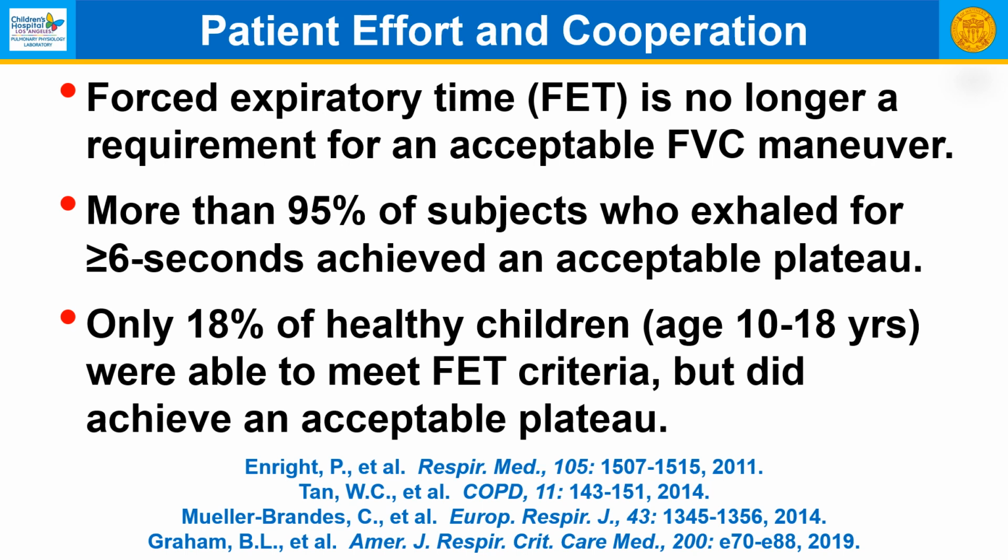More than 95% of subjects who exhaled for greater than 6 seconds achieved an acceptable plateau, but only 18% of healthy children aged 10 to 18 were able to meet the forced expiratory time criteria. Even though most did not meet that, they were able to achieve an acceptable plateau based on the 25 ml change in the last second.